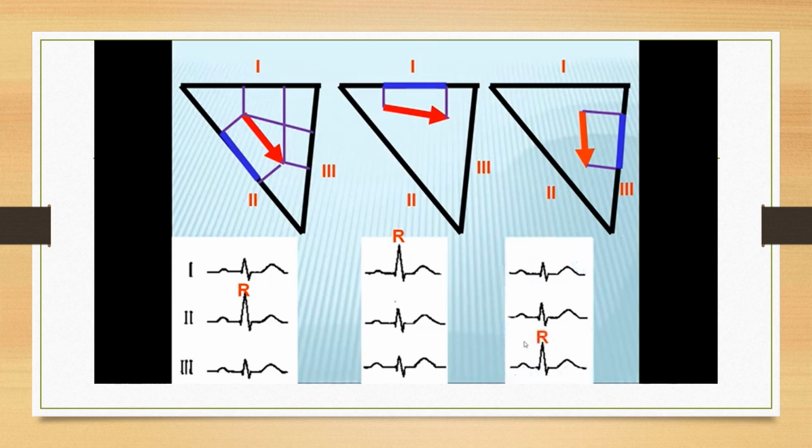But you must remember, R2 is always greater than R1 and R3 in the normal condition. And in case of horizontal, you can write the conclusion like this: R1 is greater than R2 and R2 is greater than R3. Always R2 must be greater than R3 in case of horizontal position.